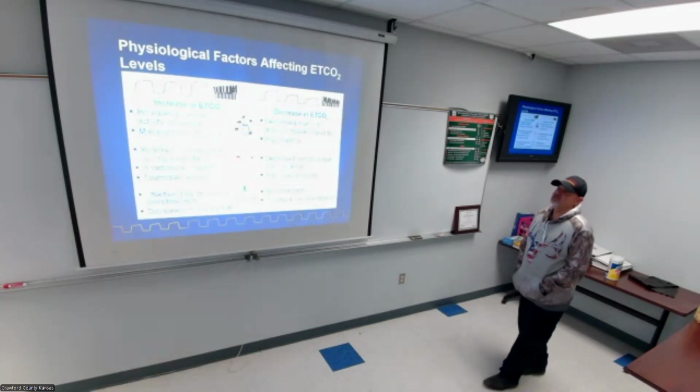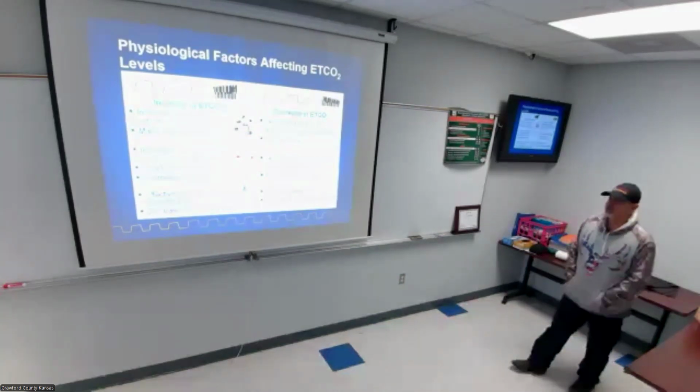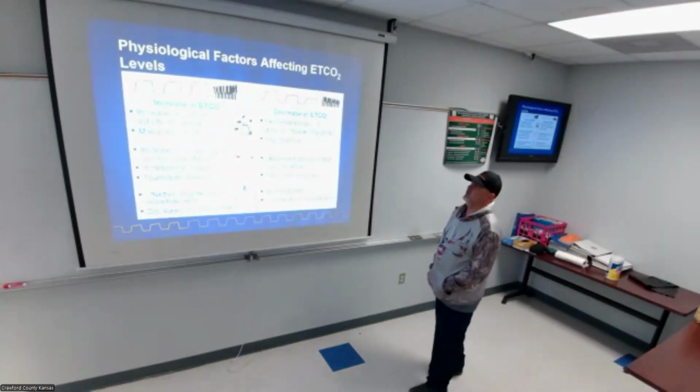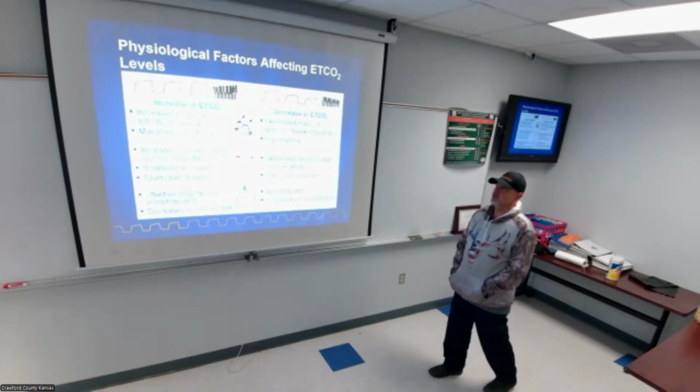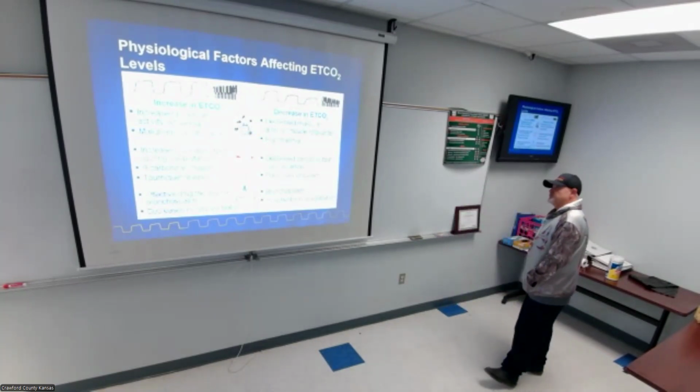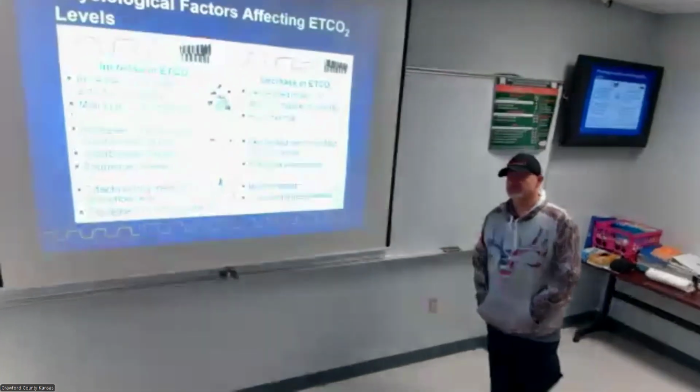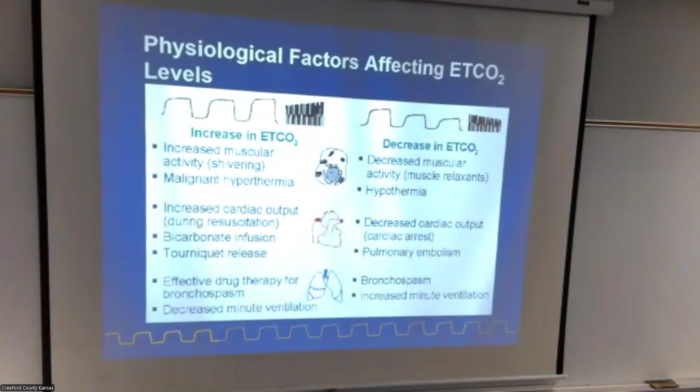So, an increase in end-tidal CO2. So we have some increased muscular activity, shivering, malignant hyperthermia, increased cardiac output during resuscitation, bicarbonate infusion, tourniquet release will do the same. Effective drug therapy for bronchospasm and a decreased minute volume. Decrease in end-tidal CO2: decreased muscular activity, such as muscle relaxants, drug overdose, hypothermia, decreased cardiac output, pulmonary embolism, bronchospasms, increased minute ventilation.